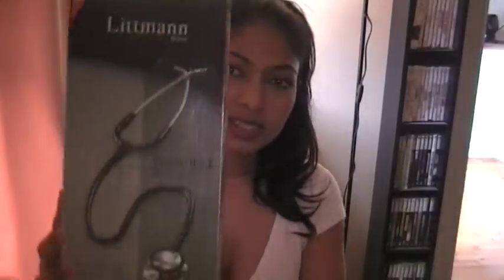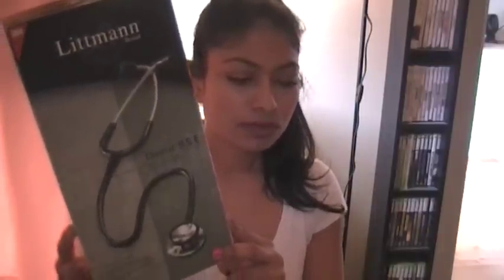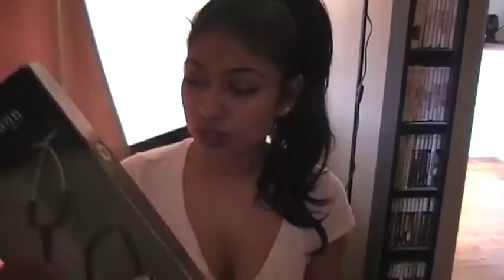I'm going to share with you my Littmann Classic 2SE stethoscope. I bought this several years ago — actually more like ten years ago. I actually bought it for my brother, though he paid more for it. I paid like $100 for it.